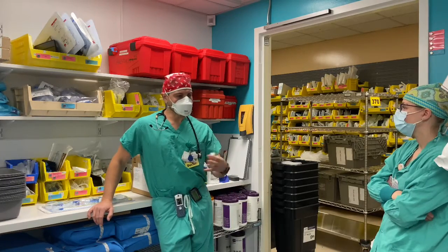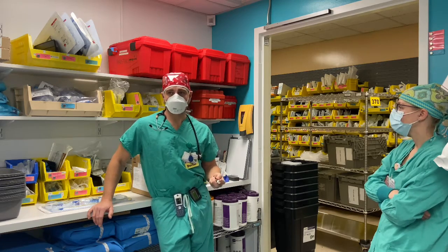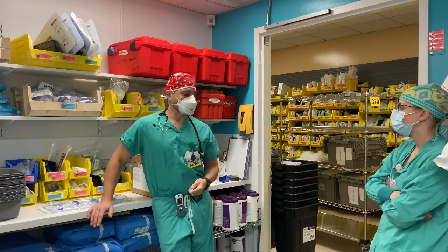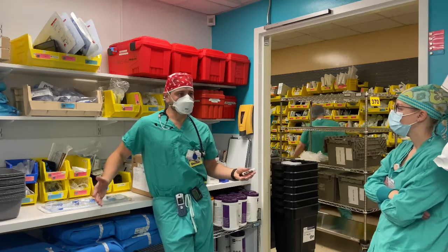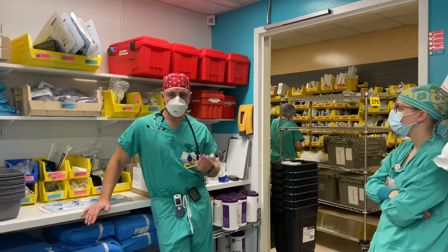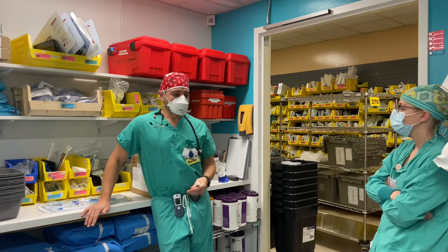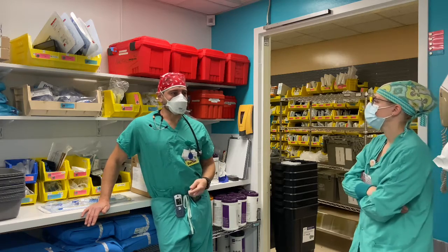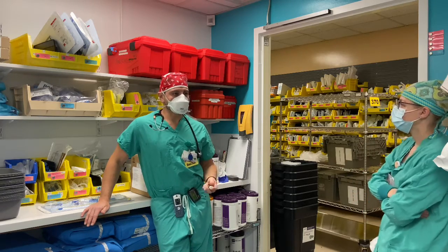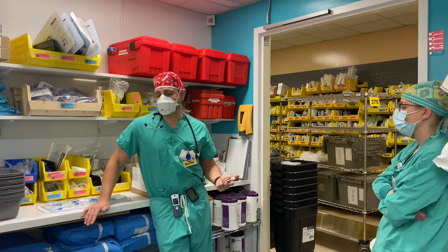Matt had mentioned that when you look at the schedule, it's sometimes hard to predict what type of airway we're going to select. The three most common types are a natural airway, in which case we're going to be using supplemental oxygen through a nasal cannula or a simple face mask. The way we decide what type of oxygen supply to use is based on, one, patient comfort, and two, the amount of oxygen that we're trying to deliver.